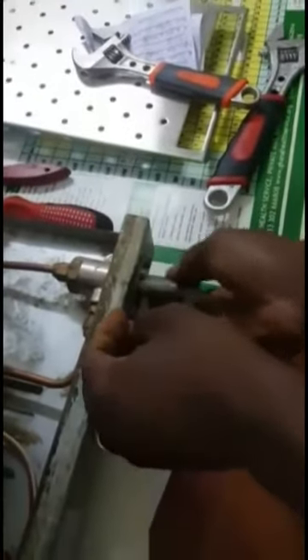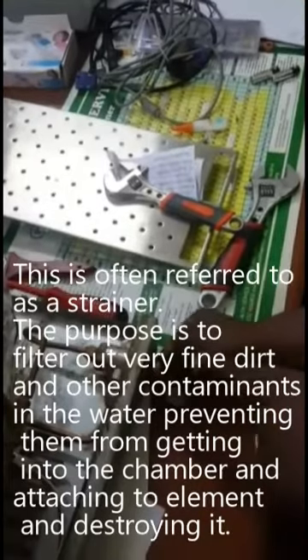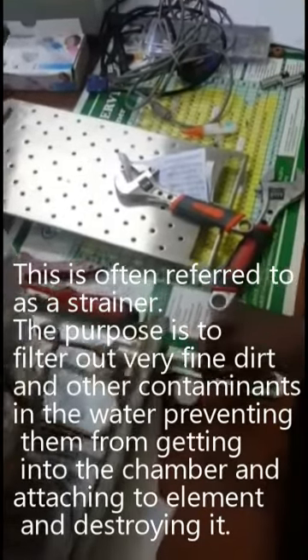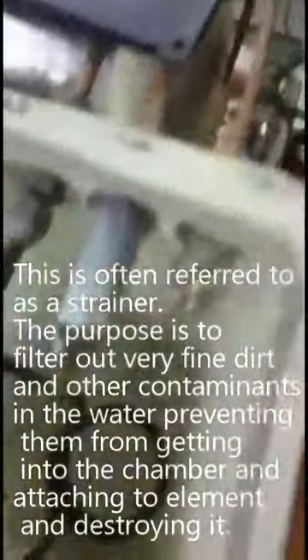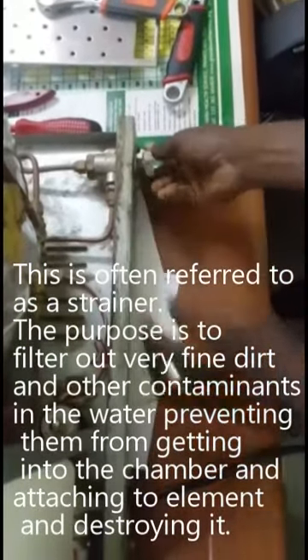We also have another filter at the back here. We open it and there is a filter inside. This is to prevent all dirt and any solid particles from entering into the chamber.